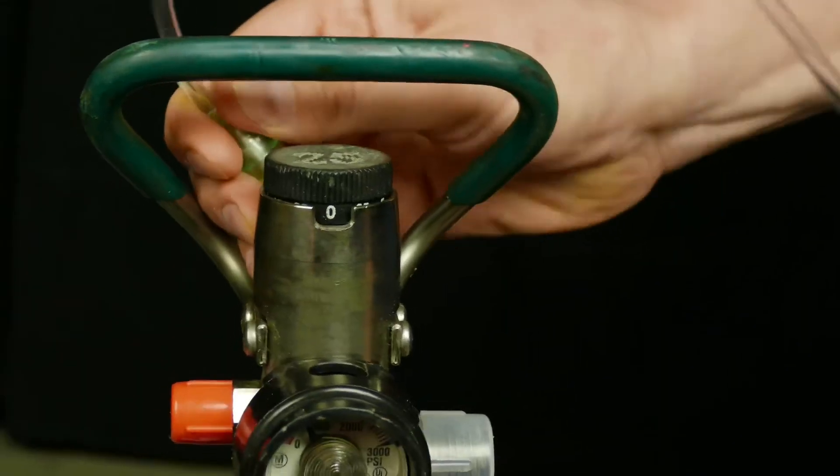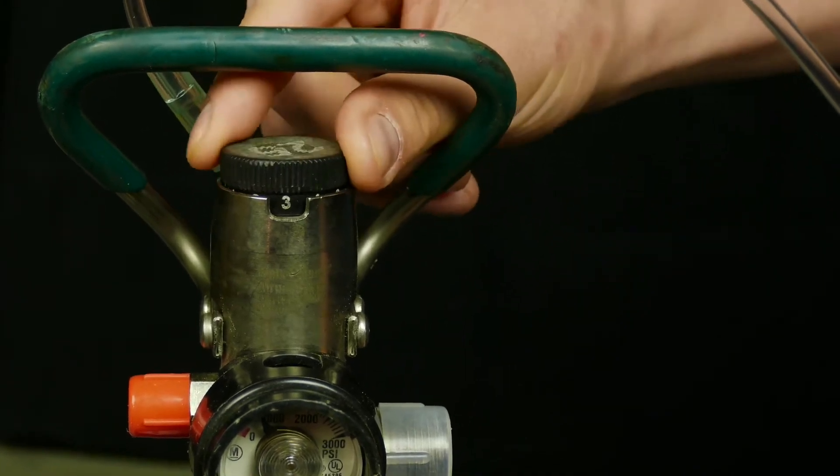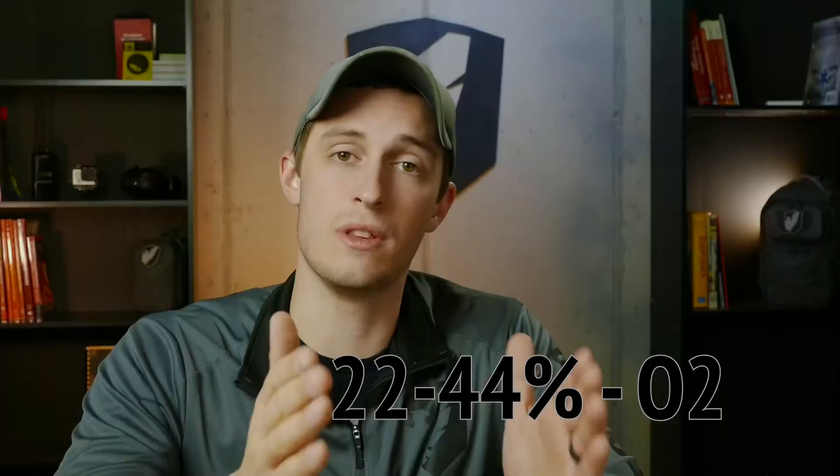There are three primary ways to deliver oxygen to a patient. The first is a nasal cannula, or nasal prongs. Apply this to the patient, set it at 2 to 6 liters a minute, and it will deliver 22 to 44% oxygen to the patient.